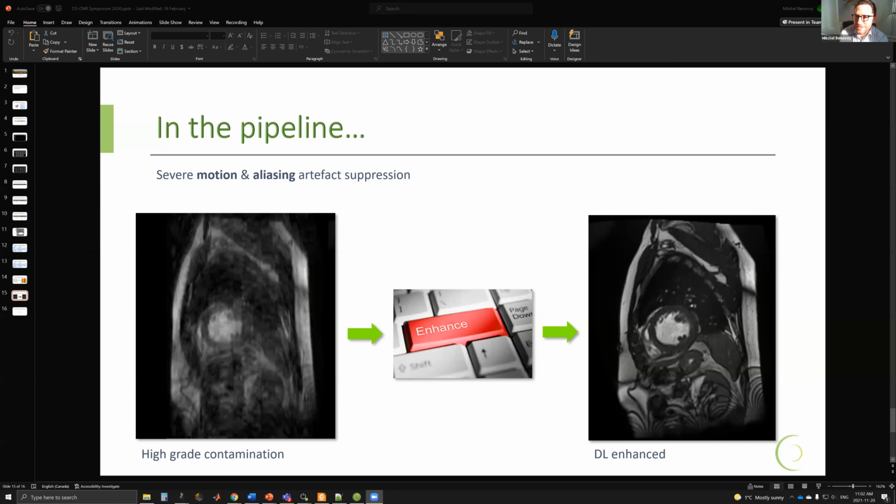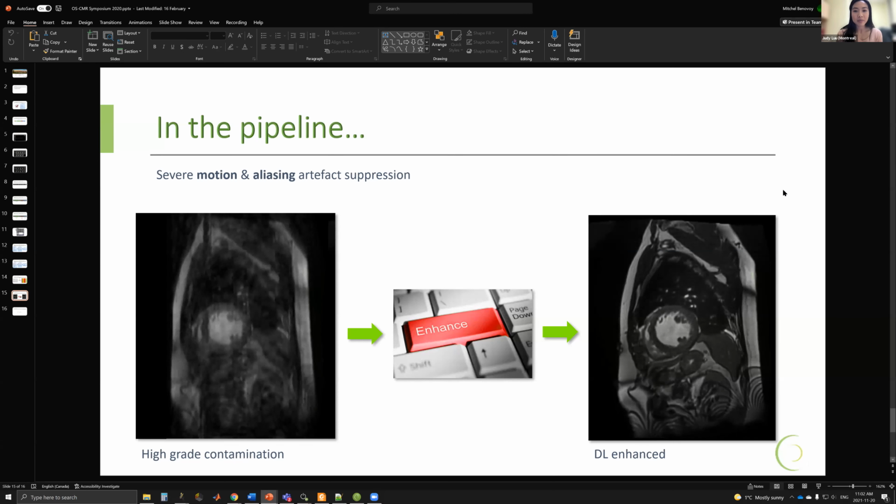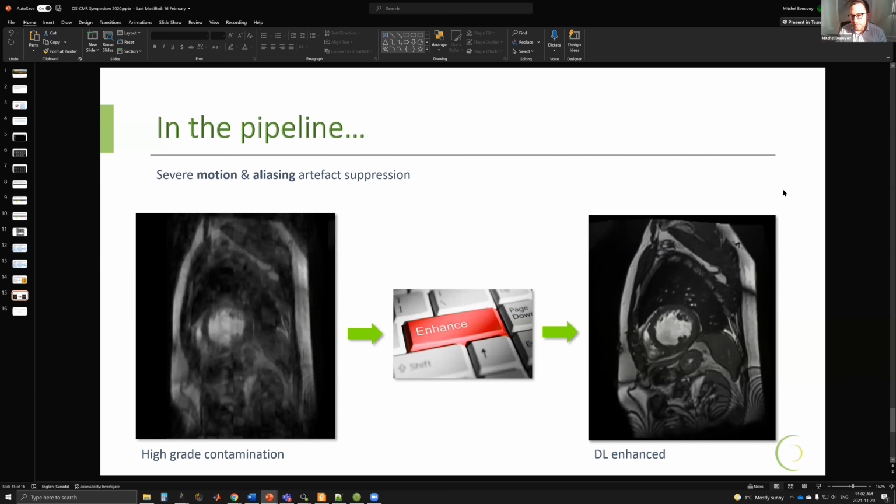Sorry, Judy, I just wanted. Oh, yeah, excellent. I promised this while I was processing. This is our deep learning based motion artifact removal system. So here you have a high grade contamination, which is what you would see in a ventilation acquisition. And this is the result through our neural network here.